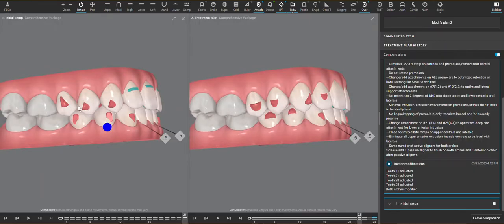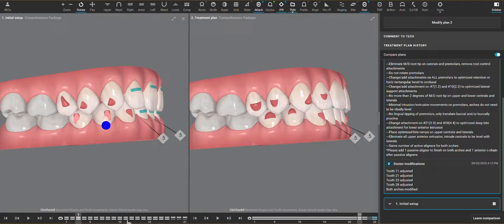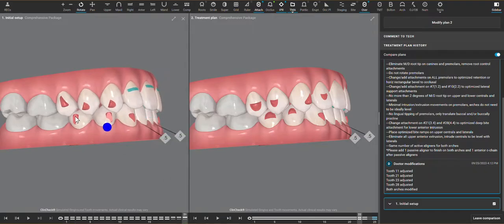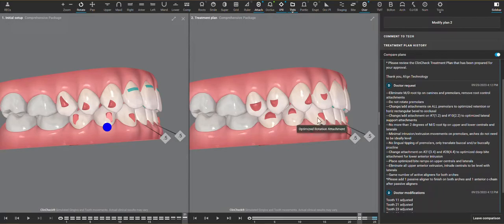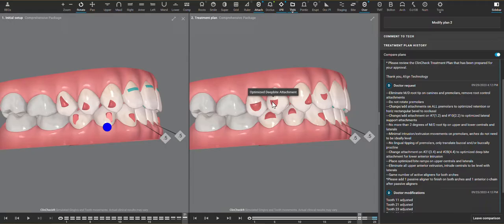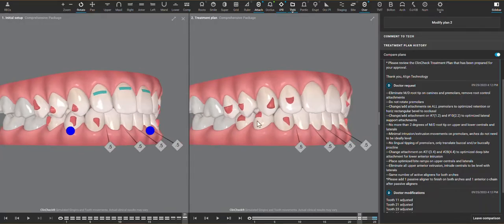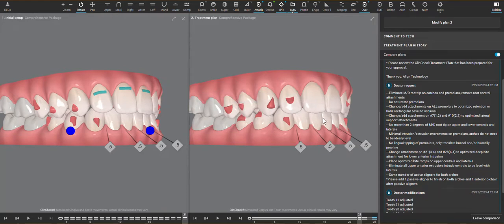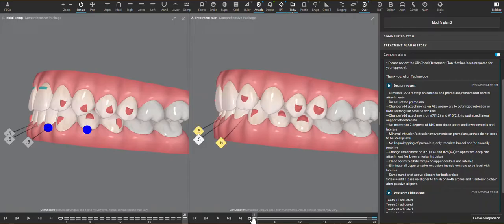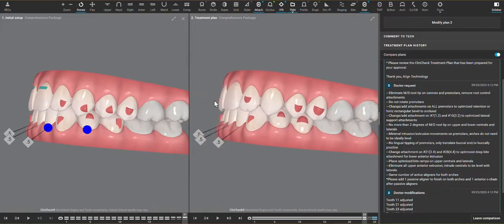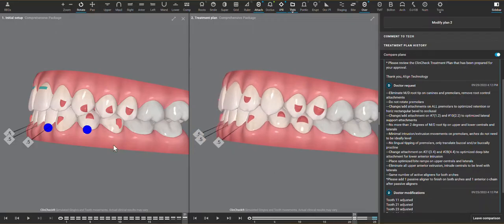So instead of doing rotation and even angulation movements on these premolars, I've asked to eliminate those movements and place retention attachments. This retention attachment and this deep bite attachment have different features within the SmartTRAC material, but they're equally fine to keep because they do provide an undercut surface so that the aligner can kind of clip into here. And then when the aligner is very well engaged with the teeth, then every other movement that we're trying to do, like the upper incisor intrusion, is going to happen more predictably.